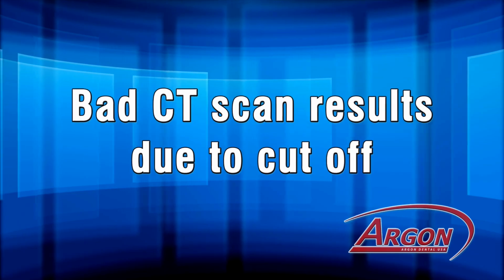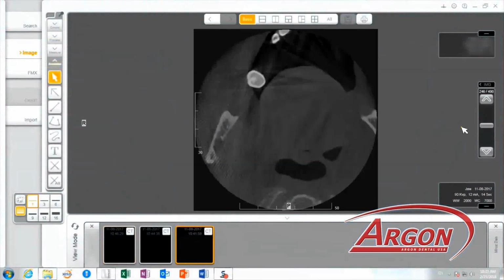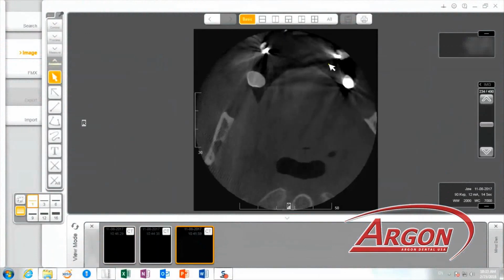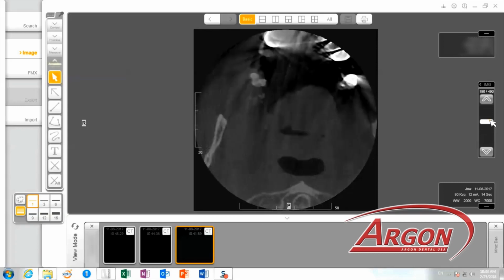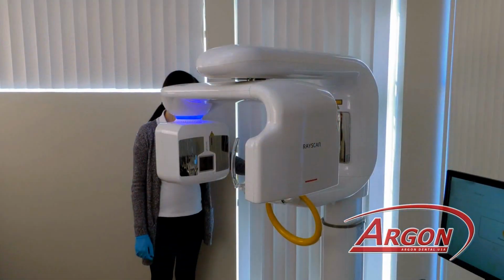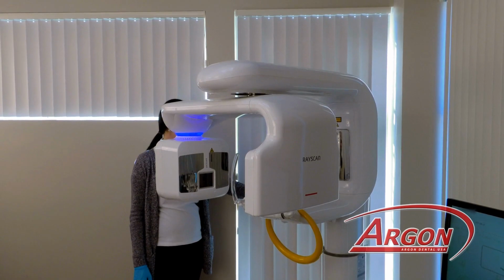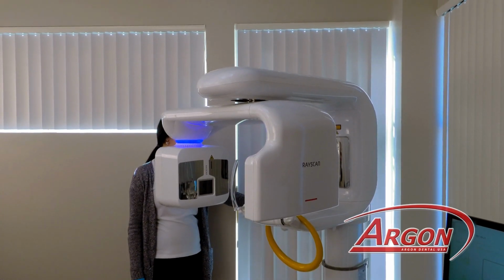Here's an example if you have the patient improperly positioned. As you can see, the whole anterior segment of the CT scan is cut off and not readable. If you see that, you would want to reposition and retake the CT. As we said earlier, you can use the scanner to take a CT scan in a standing position. You can raise the scanner up.